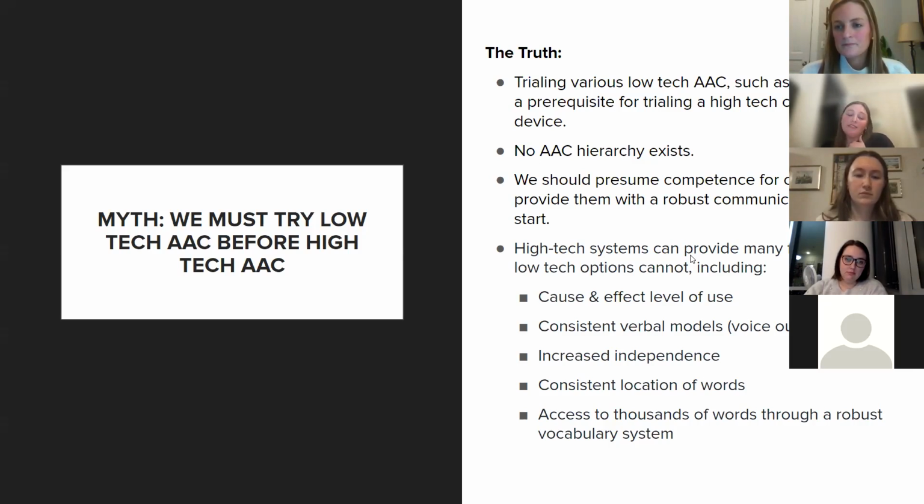So something that I've seen done is you can create your own My Phrases page on a device that you can go to, and it has those gestalts that your kiddo might be using a lot to have those accessible. I know that this is an ongoing thing that a lot of other SLPs are also really curious about. I don't know if my other fellow SLPs have more suggestions, but this is something that's developing and we're trying to learn more about as well.